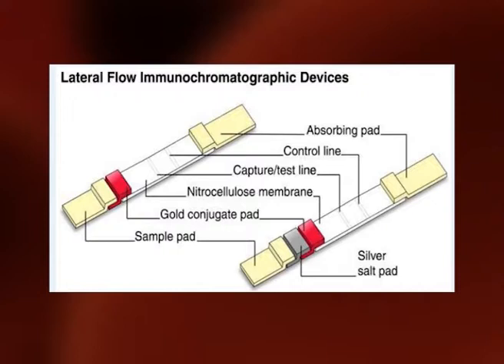Immunochromatography is one of the most important and effective techniques in the detection of species identification in serology. These assays are also known as lateral flow tests or simply strip tests, which are devices intended to detect the target analyte in a sample without the need for specialized and costly equipment. This technique is the logical extension of the technology used in the latex agglutination test, the first of which was developed in 1956 by Singer and Plotz.